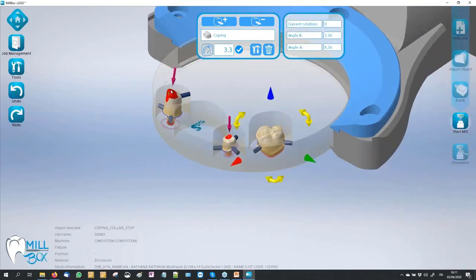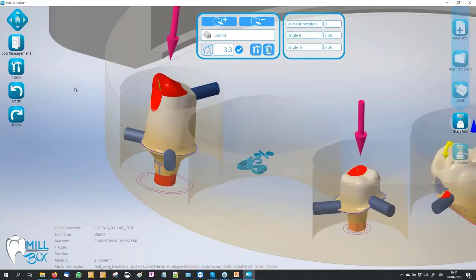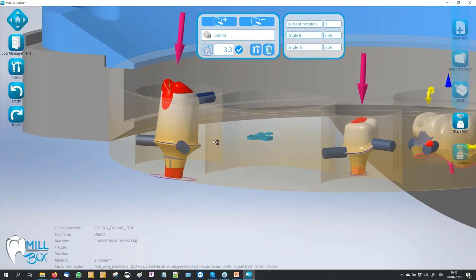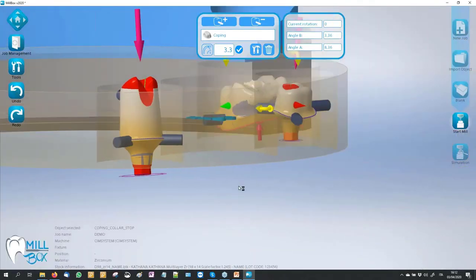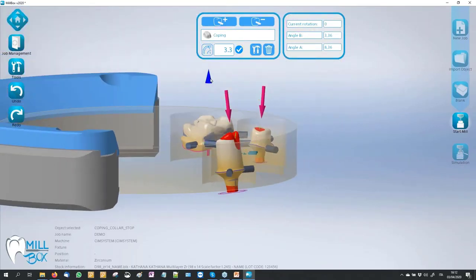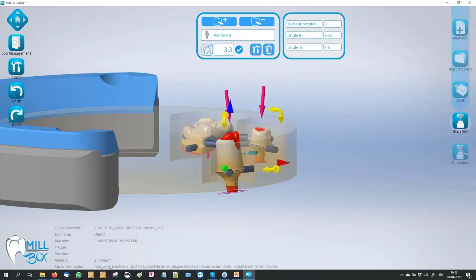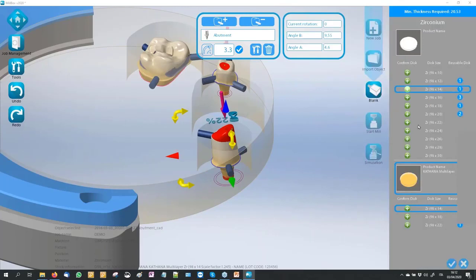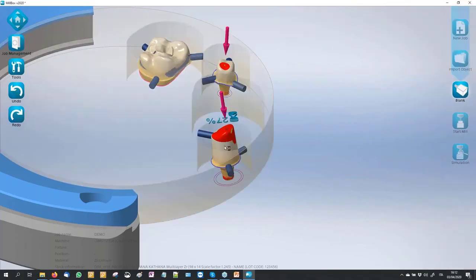I import an abutment that is much bigger than this stock thickness. You can see on first look that the customer sees on the project — this is a simple example — but our STL is not possible to mill this abutment inside this stock. The software shows us red warnings, and of course we can go back to select a bigger stock, for example 22mm.